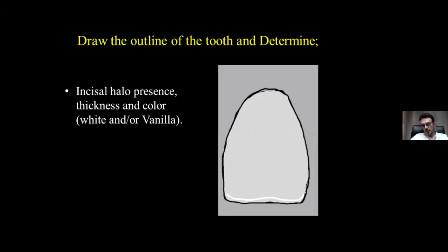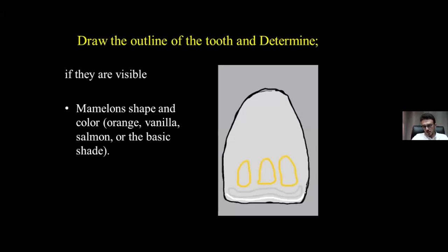So you draw the actual outline form, even if there is a fracture in the incisal edge, some wavy incisal edge, some invaginations, whatever in the proximal line angles, it has to be drawn, and then you start placing the color shapes on it. It's just a draft that you make for yourself, and then you start to place the color shapes, existing or not, writing their color.